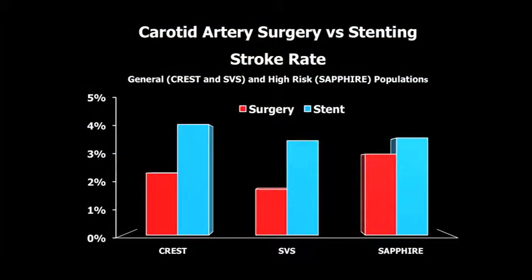So what's holding it back? Why isn't it the predominant procedure of choice for patients with carotid occlusive disease? Well, some of the advantages of stenting over the typical surgical technique is that it's less invasive, and the risk of other problems such as myocardial infarction, heart attacks is less in those patients undergoing stenting than in those patients having the open surgery. However, the risk of stroke may be slightly higher. The problem is protecting the brain circulation from any plaque or material that may break off at the time of a procedure. How has the technology evolved to help protect against stroke?